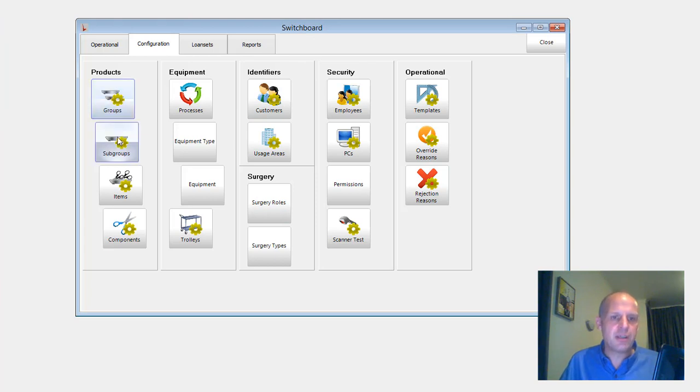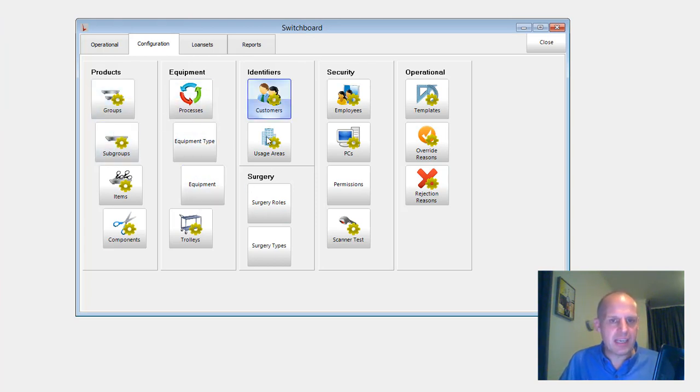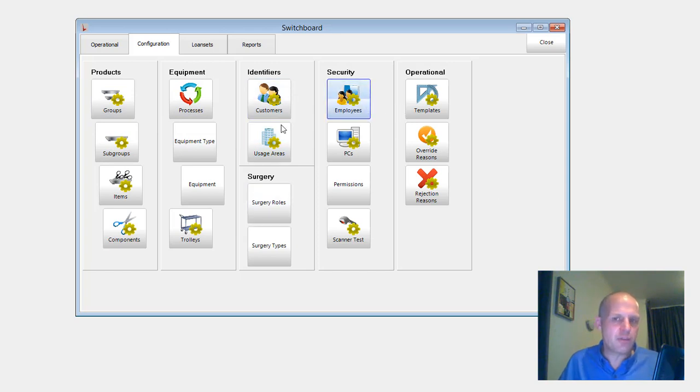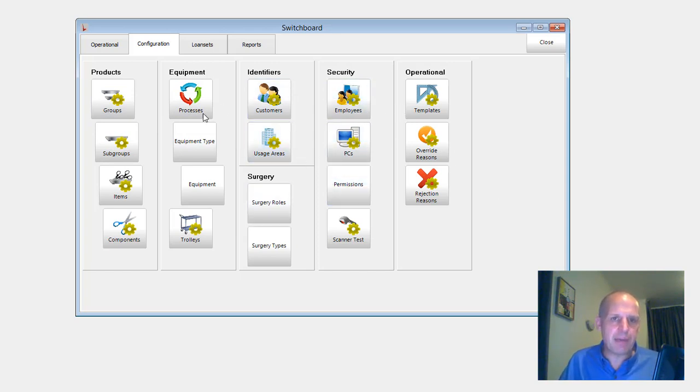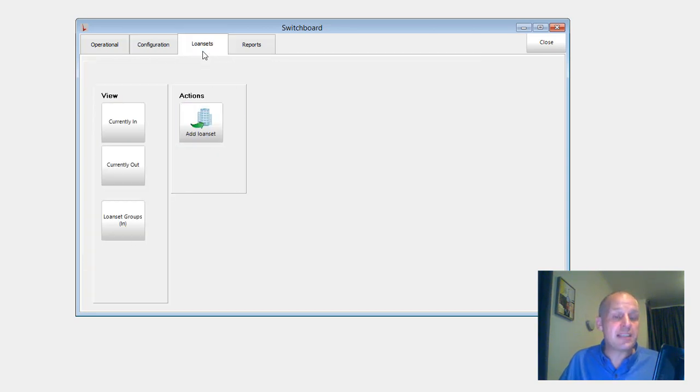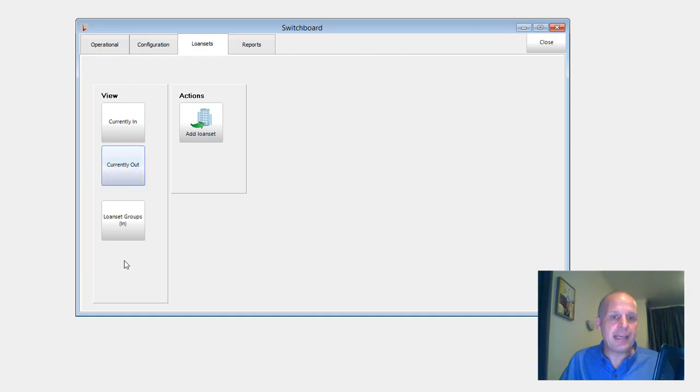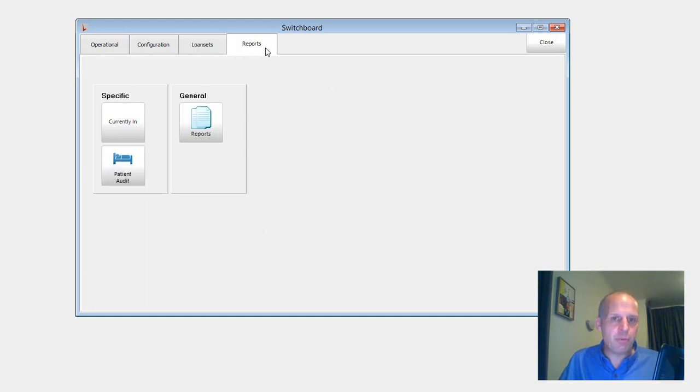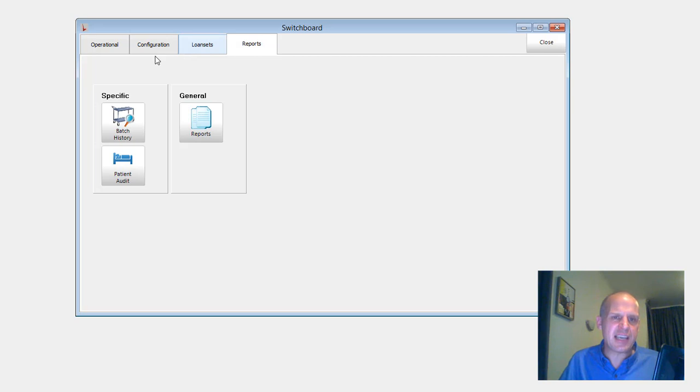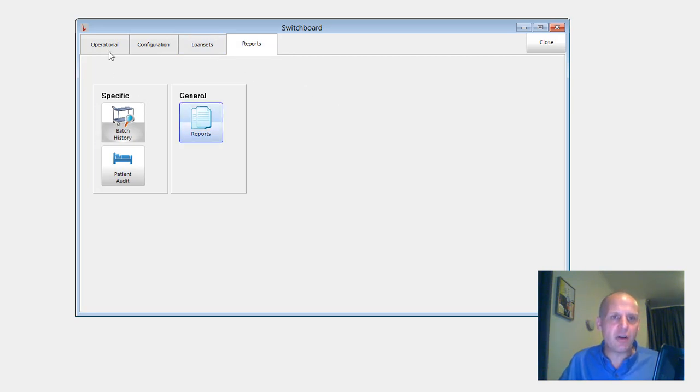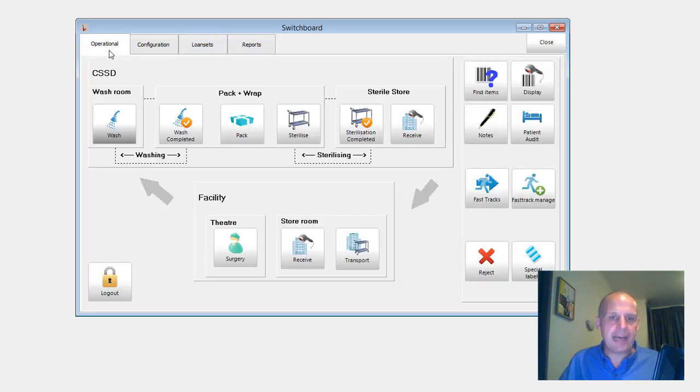Now has virtually everything that used to be up in the configure menu is now on this screen. And so groups, process, equipment type, whatever, customers, usage areas. You can see a lot of the frequently accessed sort of stuff is now a button here. Loan sets gets its own couple buttons here and I'll cover them in a minute. And then reports. There's a tab for reports. So there's a couple extra tabs and more buttons on it.